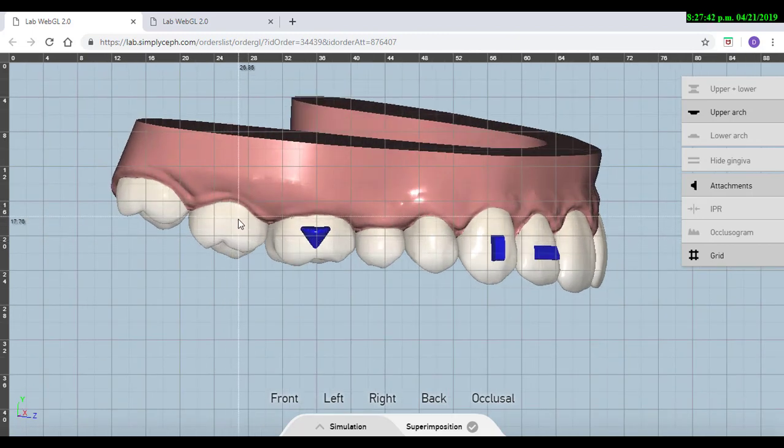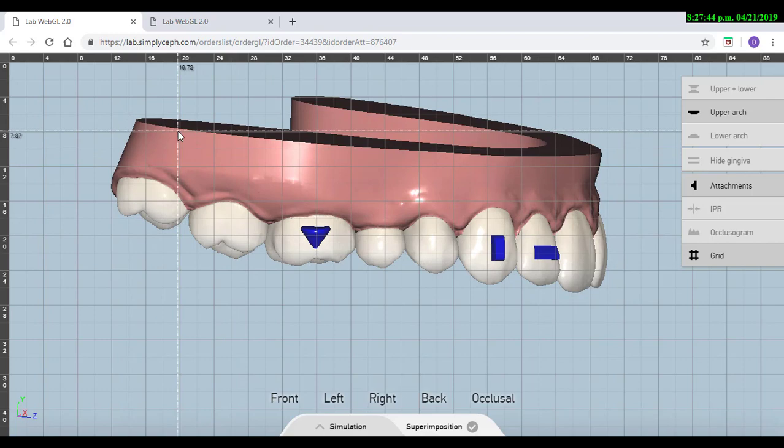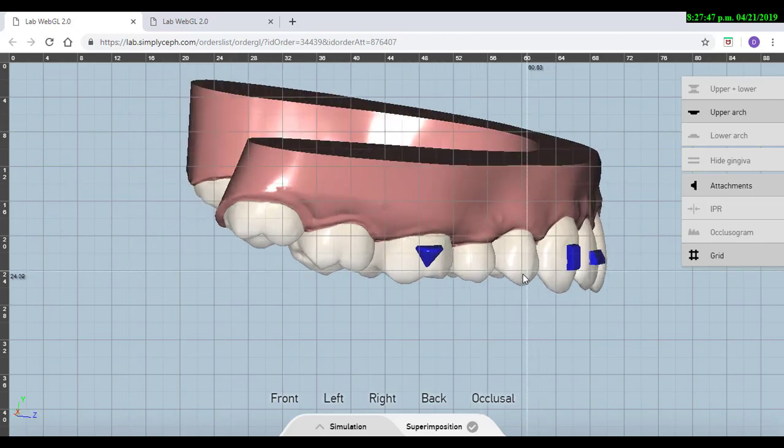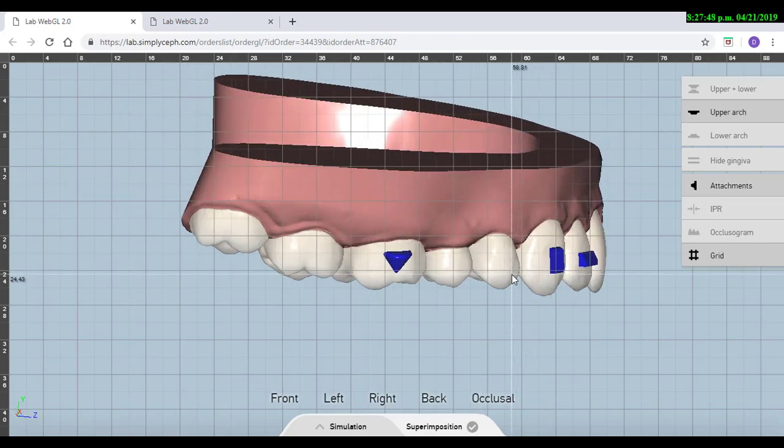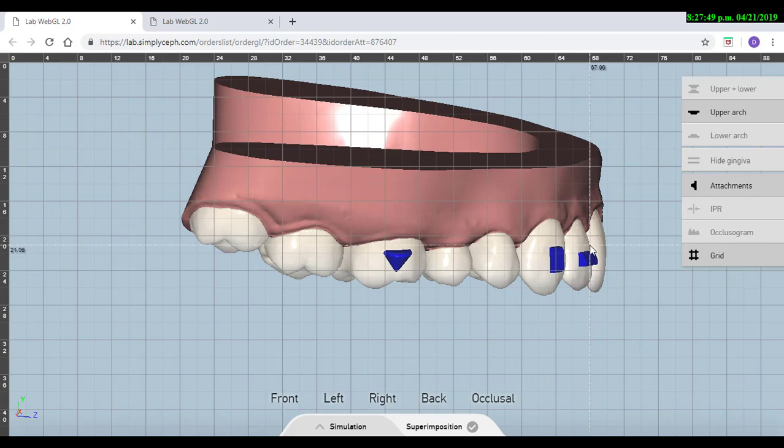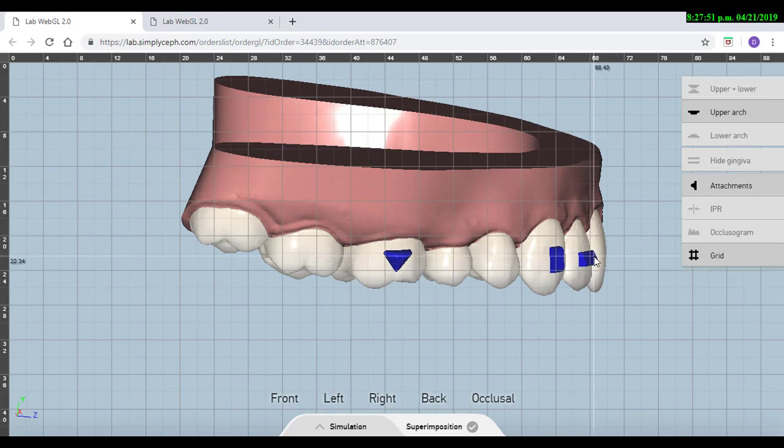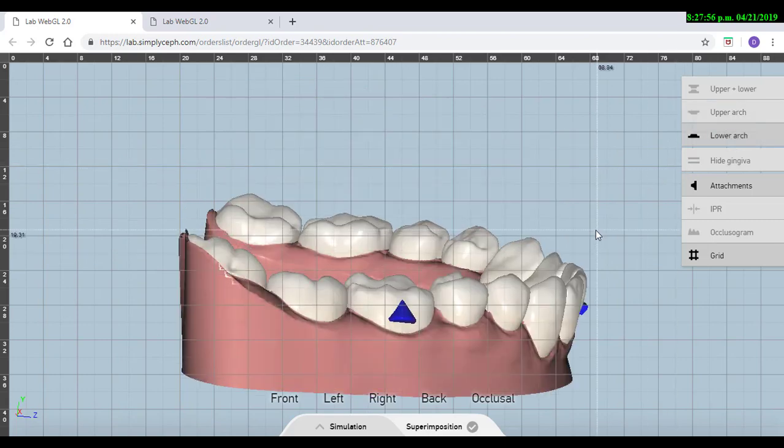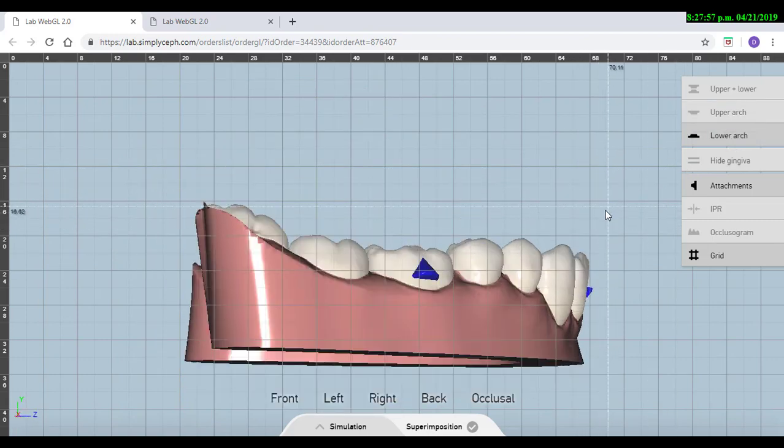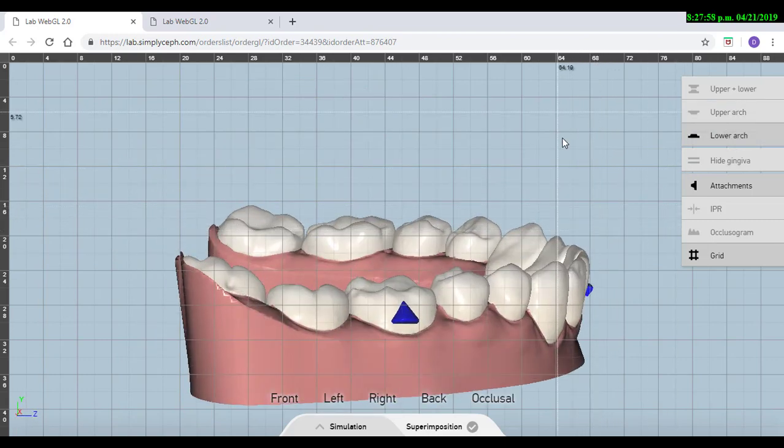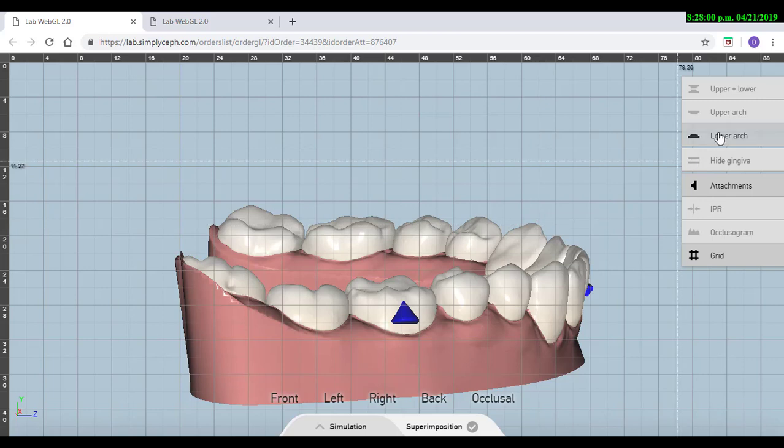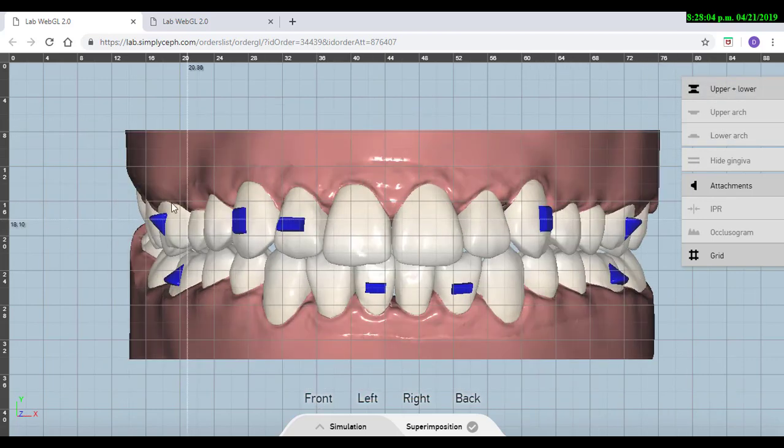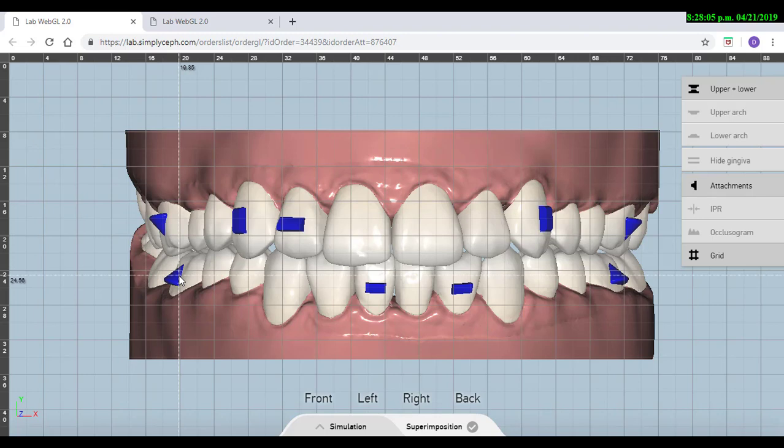Then I will check the torque, so those upper incisors normally will be with a positive torque around 6-7 degrees, and those lower incisors normally will be almost straight or even minus 1 degree, and the posterior teeth normally will have a torque that is negative going inside, so all of these things I will need to check.